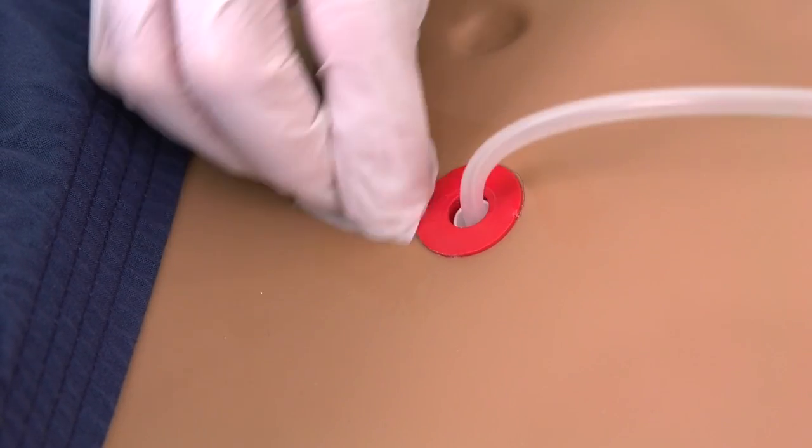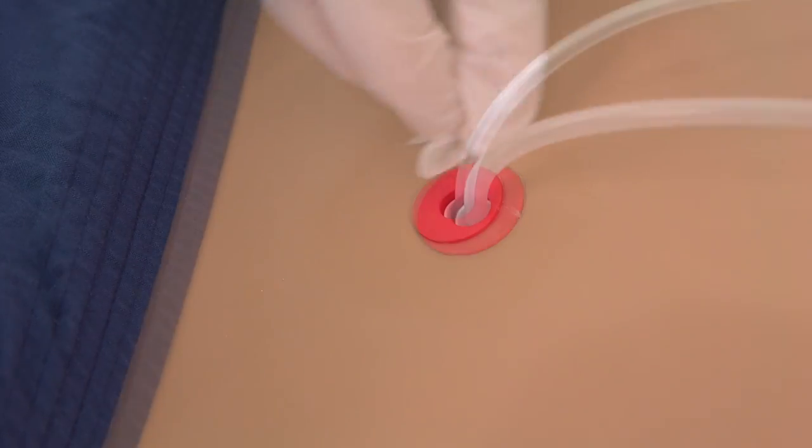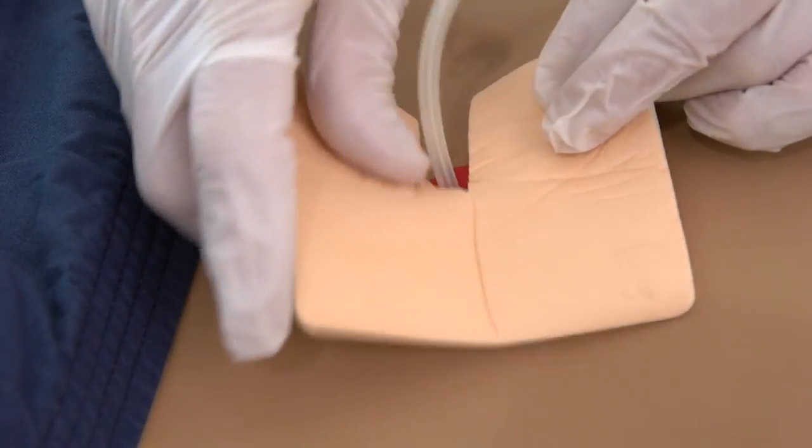Clean around the catheter exit site with a new alcohol wipe. Place the split foam catheter pad around the catheter.